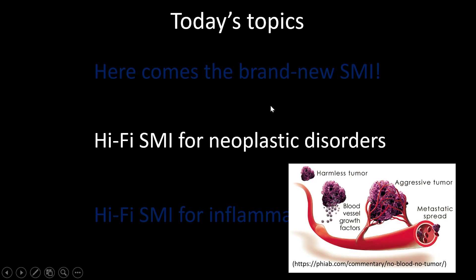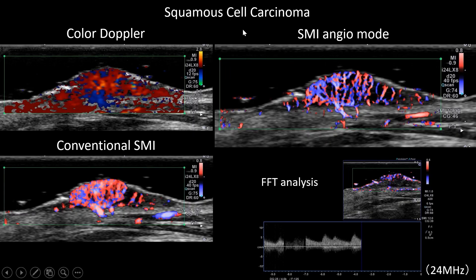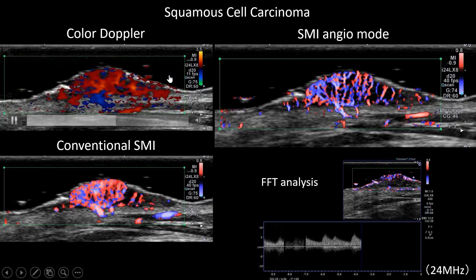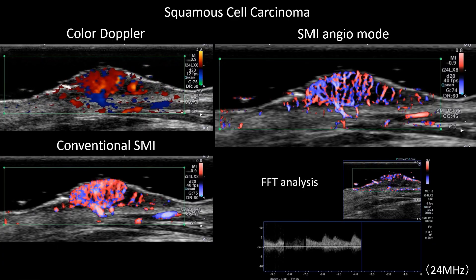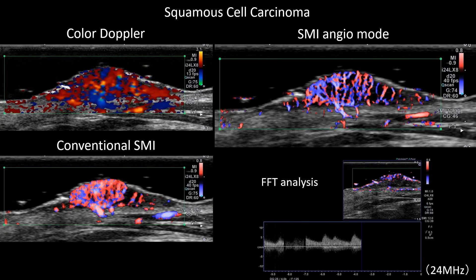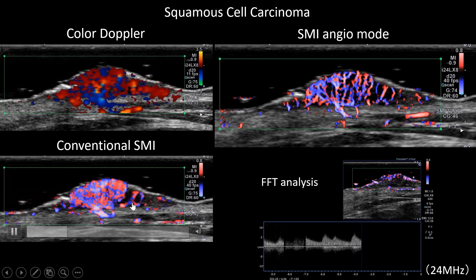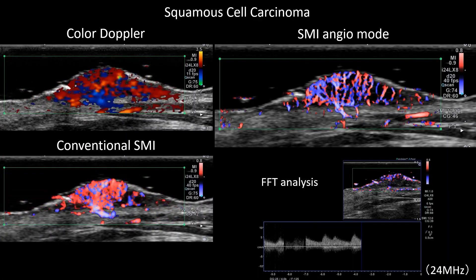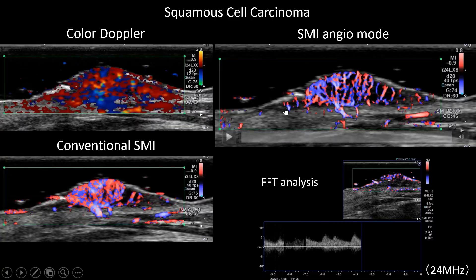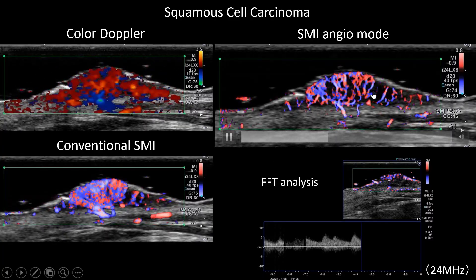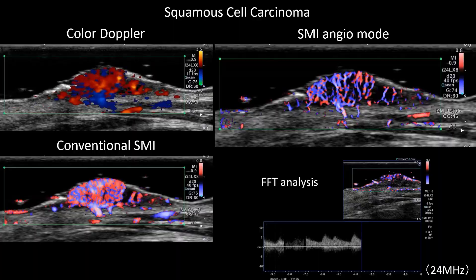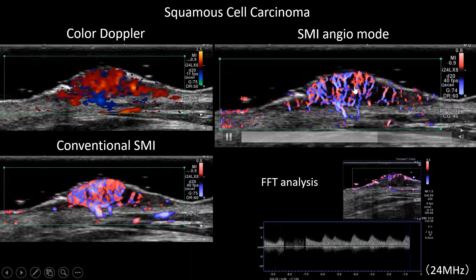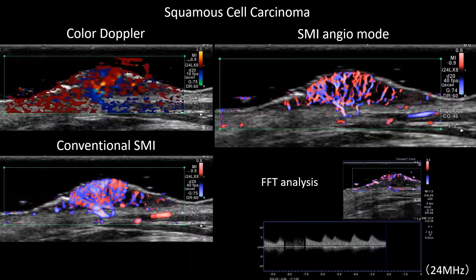First, neoplastic diseases. This is squamous cell carcinoma. By conventional color Doppler you can tell this might be a hypervascular tumor, but the image is not so good. By conventional SMI you can see bunches of blood vessels but cannot see each vessel clearly. By using Hi-Fi SMI you can see each vessel clearly, and FFT analysis confirmed these signals are true blood flow, not artifact.